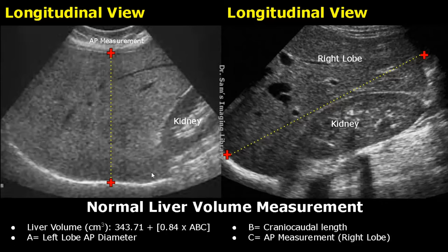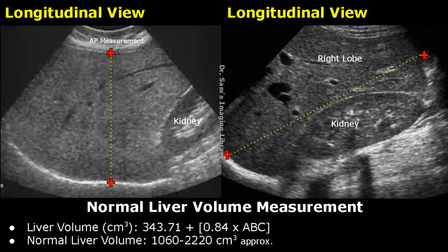After three values are obtained, liver volume can be measured. The formula for measuring liver volume is 343.71 plus the product of 0.84 times A into B into C, where A is the AP diameter of the left lobe, B is the craniocaudal length of the liver, and C is the AP measurement of the right lobe. The normal range for liver volume is between 1060 and 2220 cubic centimeters.